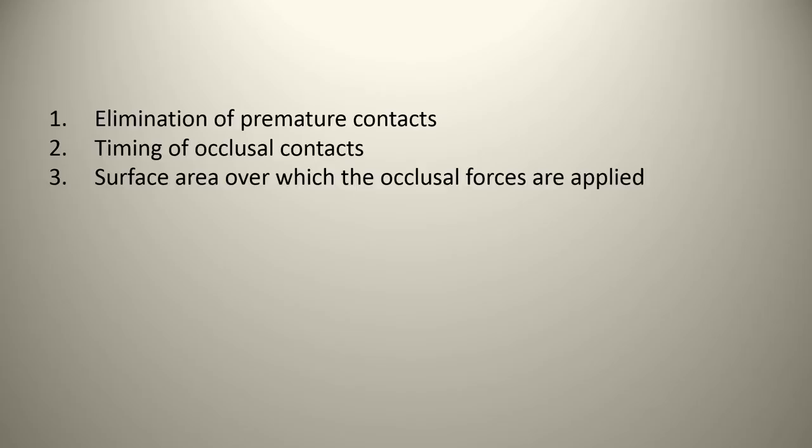You also want to consider the implant angle to the occlusal load. So many times implants are put into the bone at an angle at which the bone was basically there. And this will sort of handcuff you from an occlusion perspective. So know that if an implant is angled, you want to ensure that the vector forces that are acting on that implant are not going to be problematic.